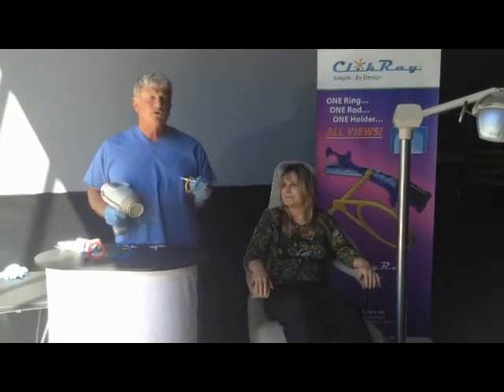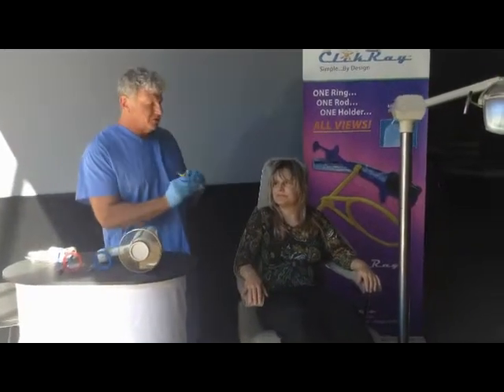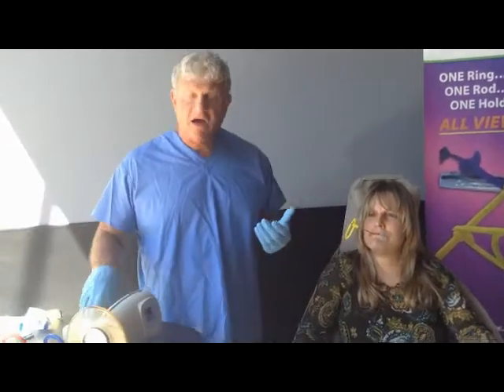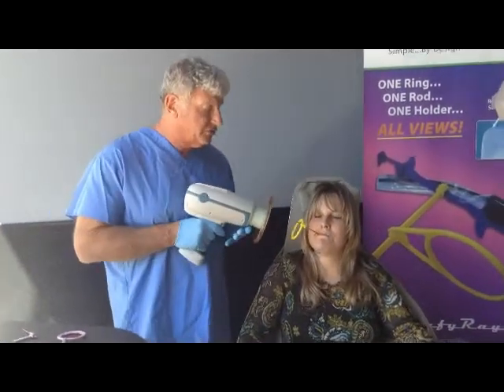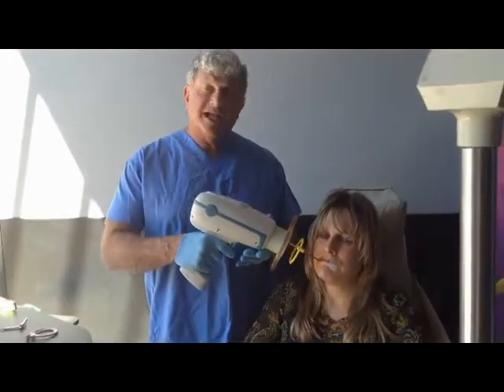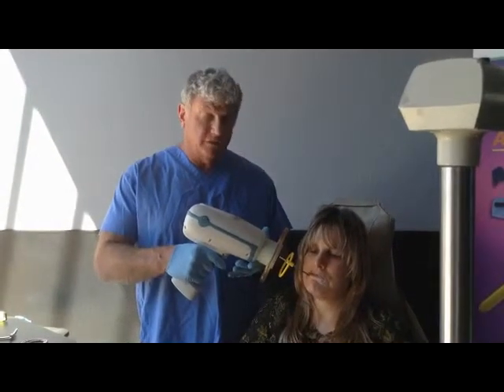First off, let's show you a traditional system to take a posterior picture. The sensor is placed in the patient's mouth. When the patient bites down and we're going to use this handheld x-ray unit, we can only get it as close in as the length of the rod allows. The rod is closing in and clashing with this.